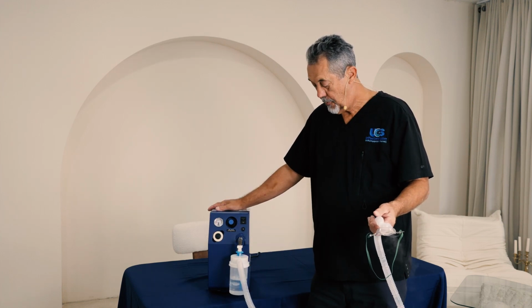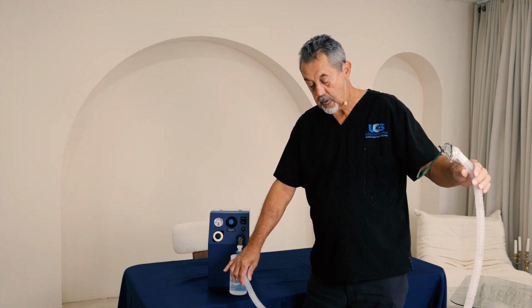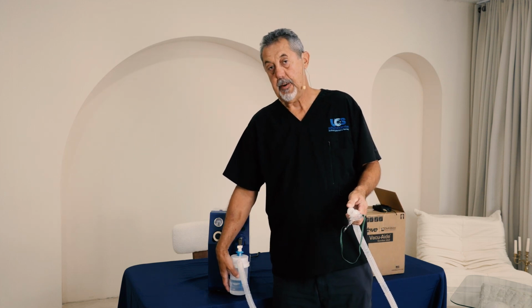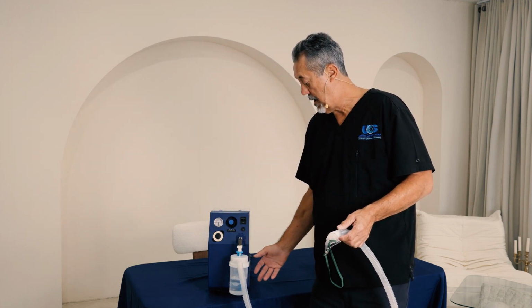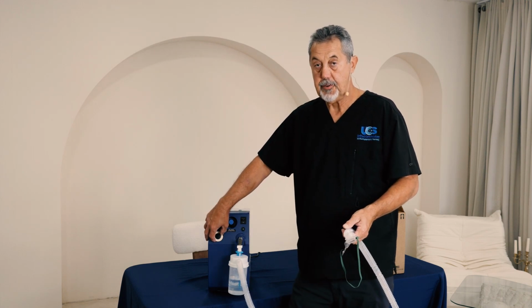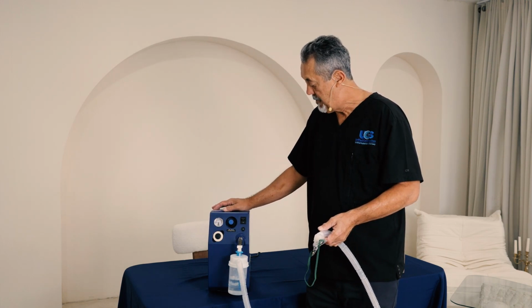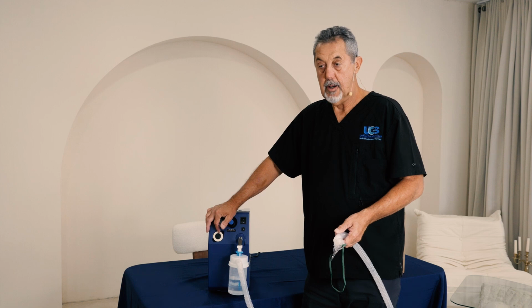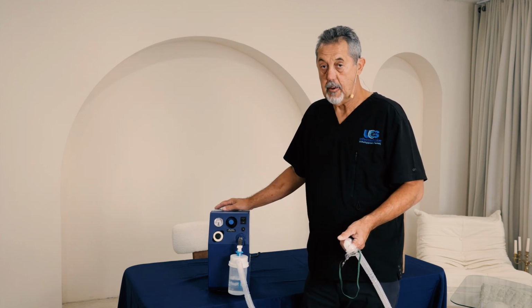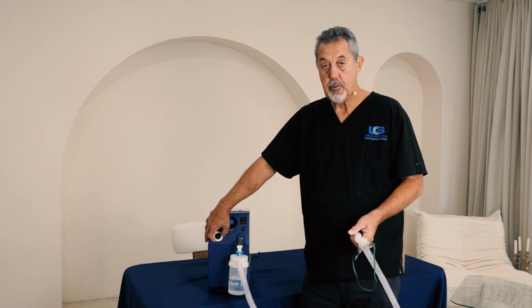So just to recap real quick, replace your whole circuit on a weekly basis, wash this every day, and once a week you want to disinfect the large volume nebulizer the way I just described. This filter here, you do not wash this filter, you replace it. The manufacturer actually says 6 months to a year, so it all depends on how dusty the environment is. You don't wash it, you replace it.